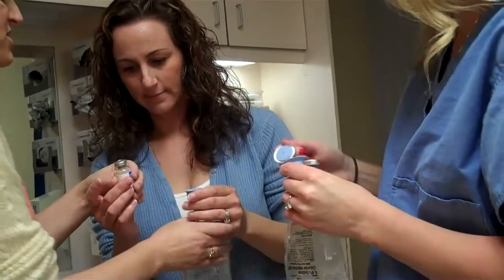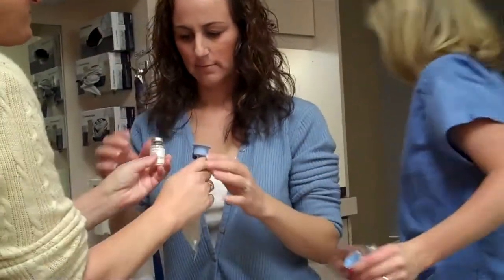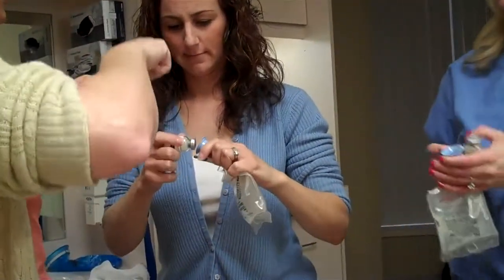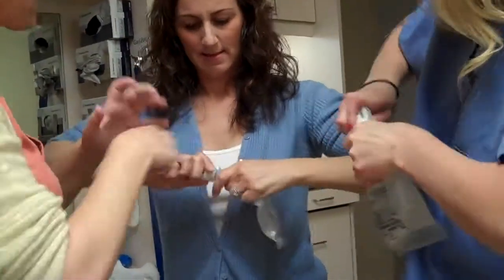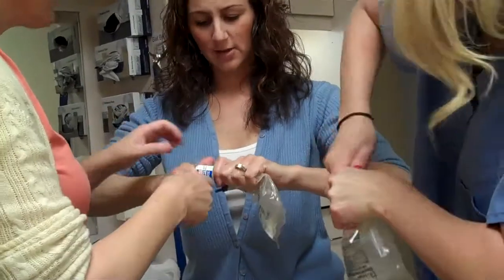And now, do this one? This is just a spike. So you're just going to spike those babies together and push hard, and you might have to twist a little bit. You're poking through it. Use a little muscle. There we go. Good. Do you kind of feel how it went through?